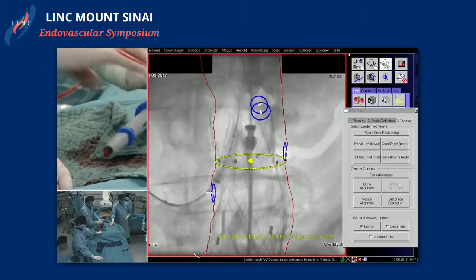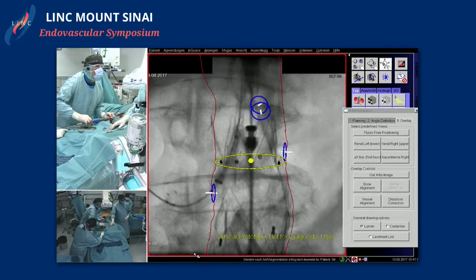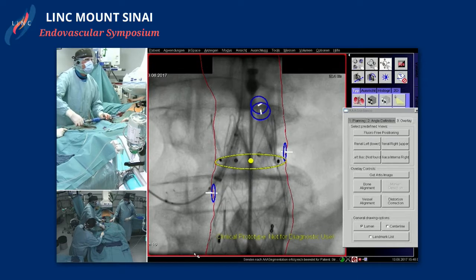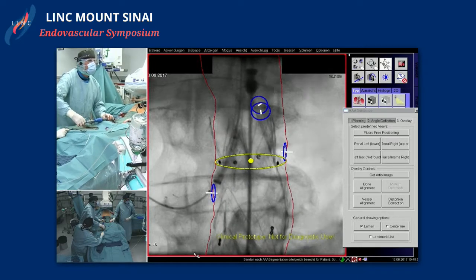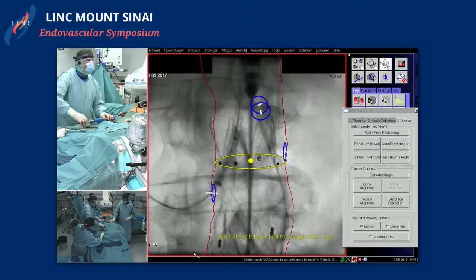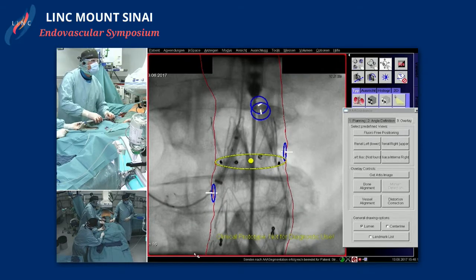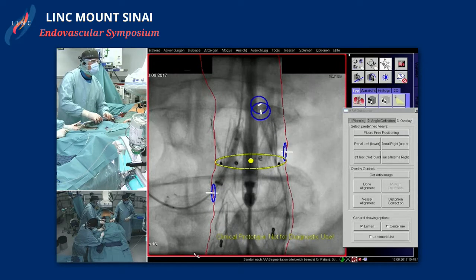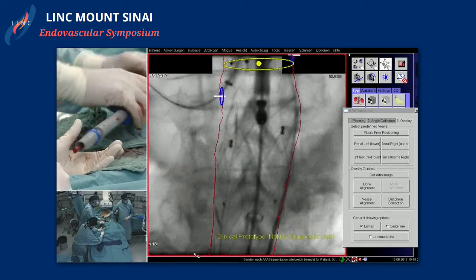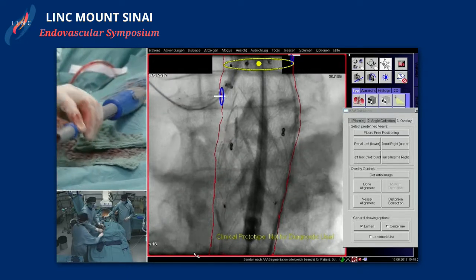So now we have placed our aortic graft. I think one important point is when you extend an old endograft repair with suprarenal fixation to cover, if possible, the whole bare springs. Because if you don't cover the whole bare springs, you may have some endoleakage from above. So we can park this now.